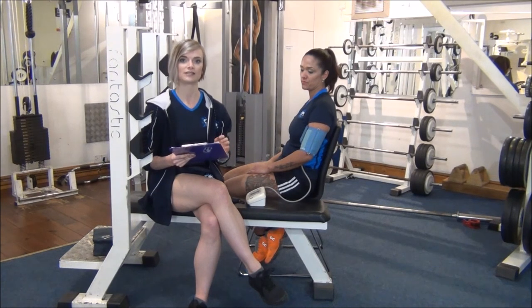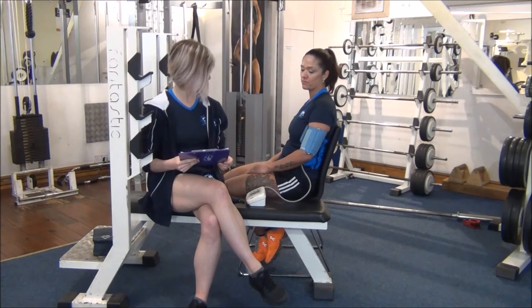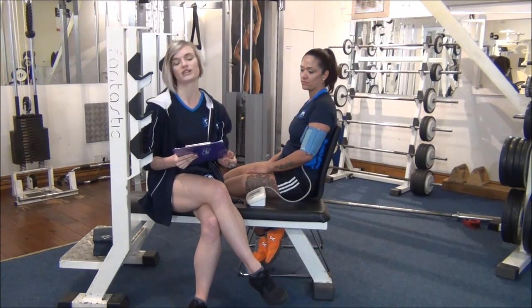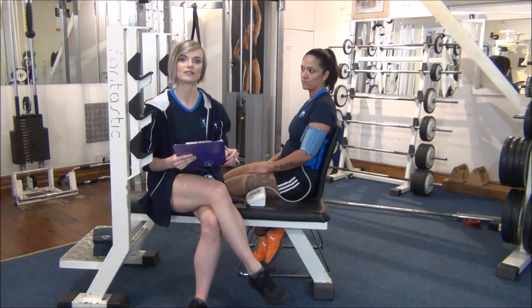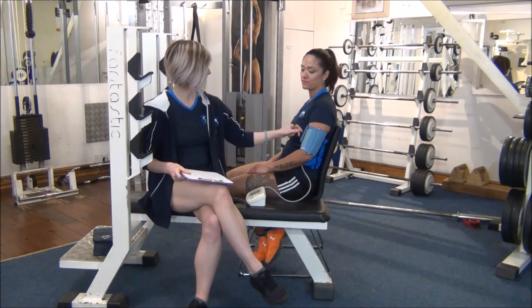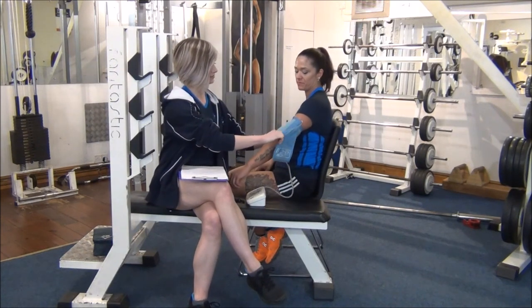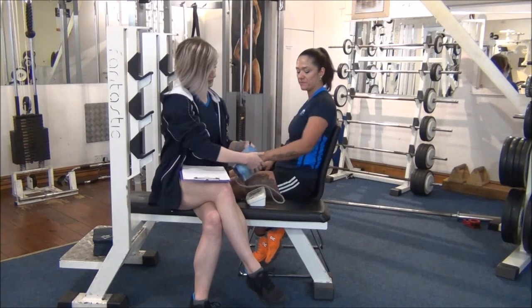Remember that food affects the readings, so make sure that the client hasn't eaten anything for a couple of hours beforehand. The resting heart rate here is 73, and the World Health Organization says that 72 is the average resting heart rate. Just remember to take the cuff off your client once it's done, and that's you done.